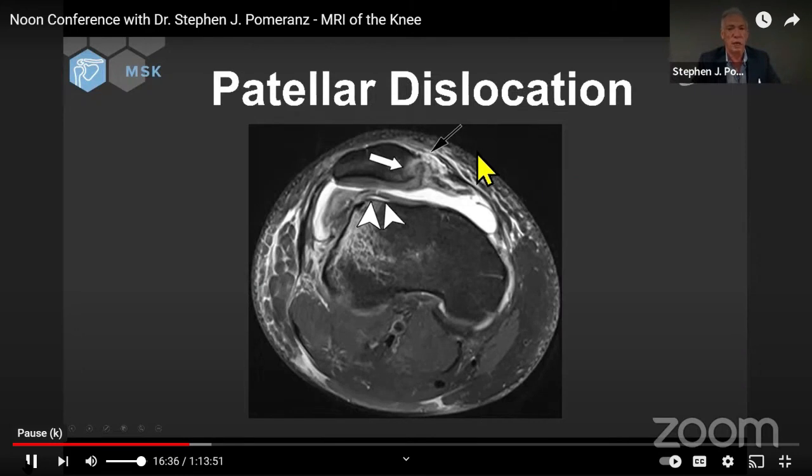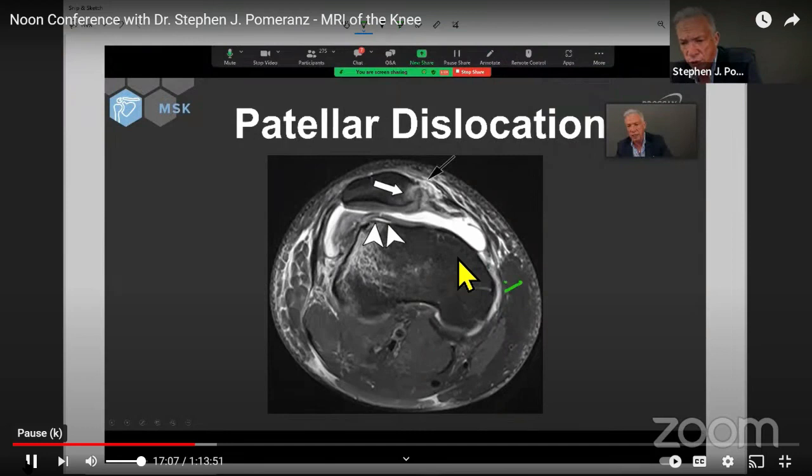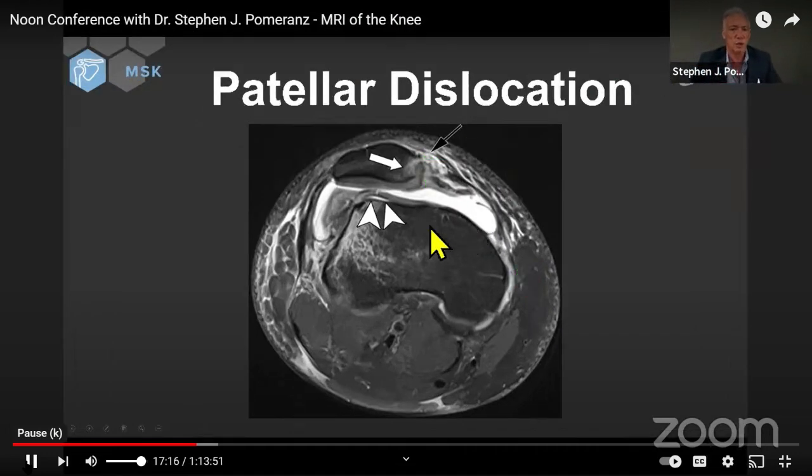One that I promised I would show you is the patellar dislocation syndrome. I'm not going to show you a full-out knee dislocation, although I may have one later on. I take that back. But here's another example of non-kissing abnormalities. There's one microtrabecular big-time fracture, anterolateral femur, but the other fracture is over here. How did they find each other? The patella slid over the side, and the medial patellofemoral ligament, which usually tears over here near the adductor tubercle about 80% of the time, this time it tore at its patellar reflection. It completely tore off right there. Patellar dislocation syndrome inferred by the pattern of non-kissing bone injuries.